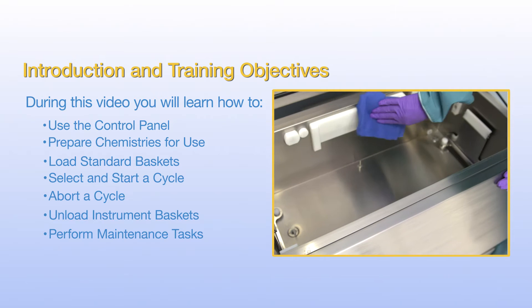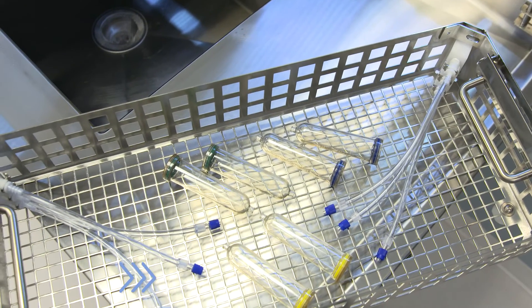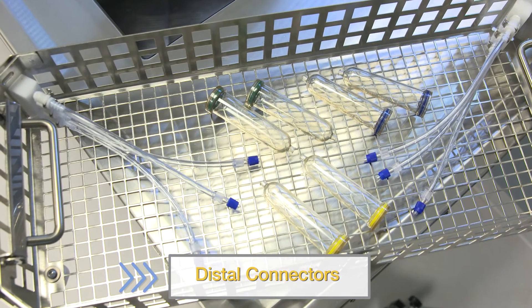Let's start by reviewing the main components. Your InnoWave Ultra Plus comes with a basket, one set of instrument tubing, and an assortment of distal connectors for flushing.